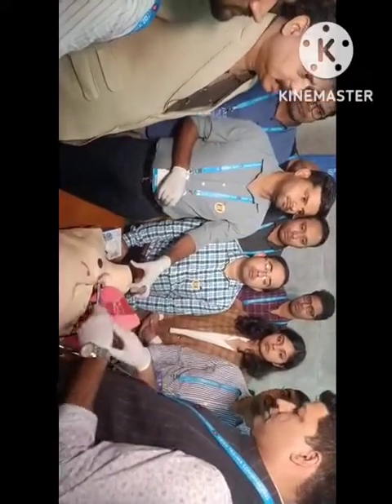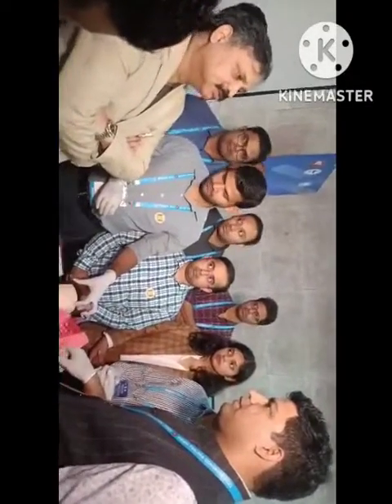And what are the other clamps you can use? This is Satinsky, or you can use other great clamps, or a sponge holder. No, another great vascular surgeon, the clamp is named after him. DeBakey. Yes, that one. DeBakey clamp. Have you read his book? Not the book, his chapters. No, read his biography.